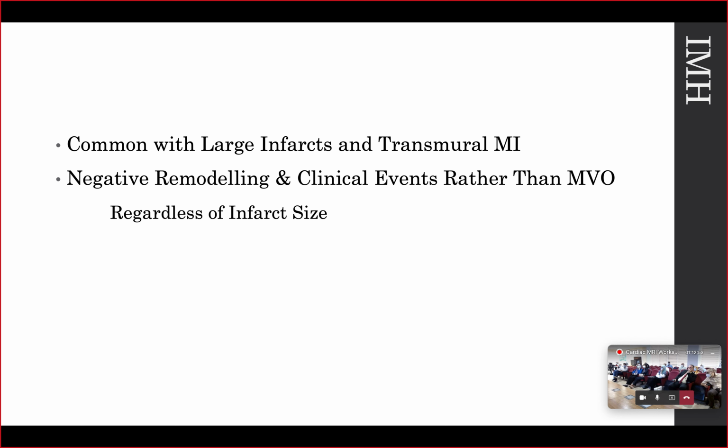Intramyocardial hemorrhage, the research is now saying, correlates with the morbidity and mortality of the patients more than the MVOs, more than the microvascular obstruction. And this reflects how important it is to detect and see areas of intramyocardial hemorrhage in those patients, because this is going to be an important indicator for the prognosis of those patients.